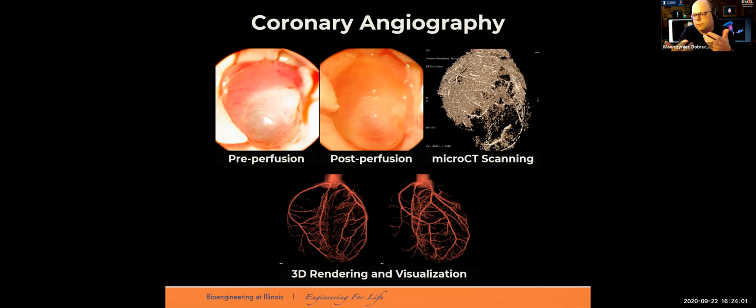You can do some quantification. We applied other algorithms to look at the diameter histogram, trying to find out the diameter of the different vessels in this image, and how, for example, a therapy or physical exercise changes this. So it was a really great study, but the acquisition took like 4 hours per specimen, and the processing was also a multi-hour processing time.